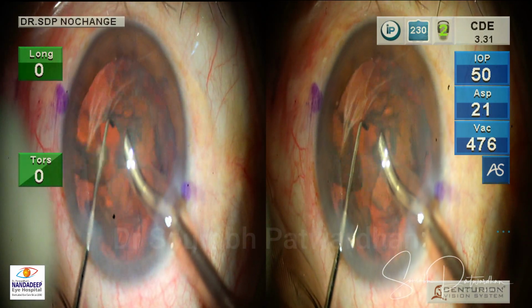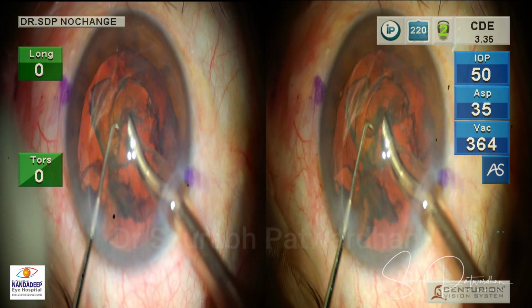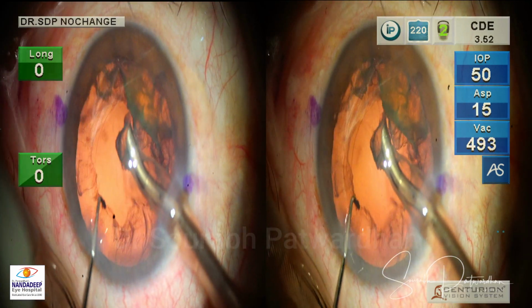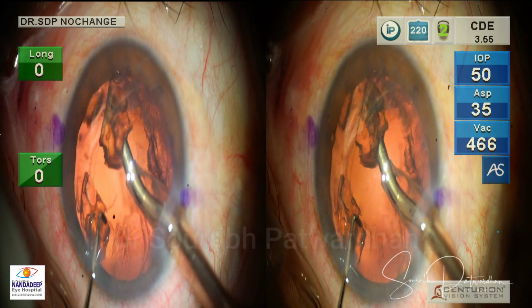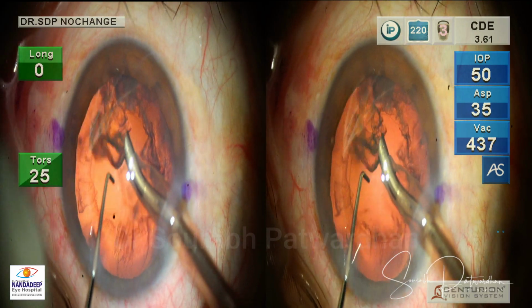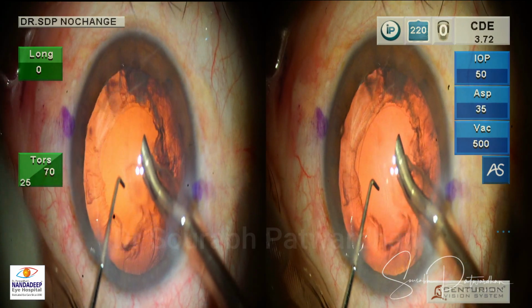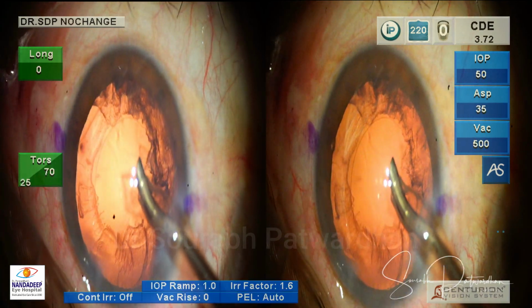Most of it is being taken by the aspiration only. You can see that. And the plane here which I have kept is the iris. It's not at the CCC, but you can see that it's at the iris plane.